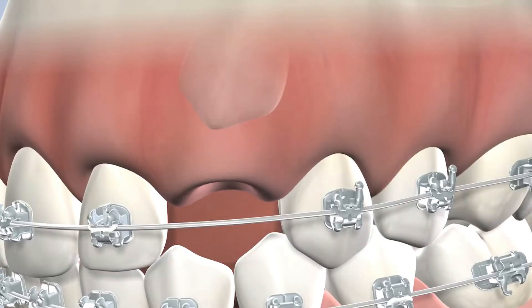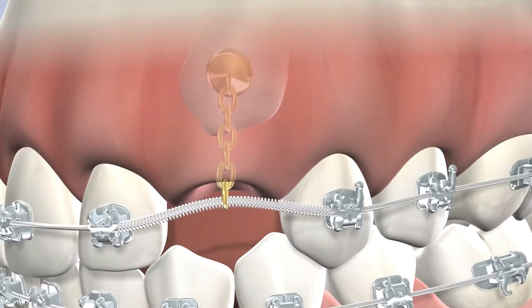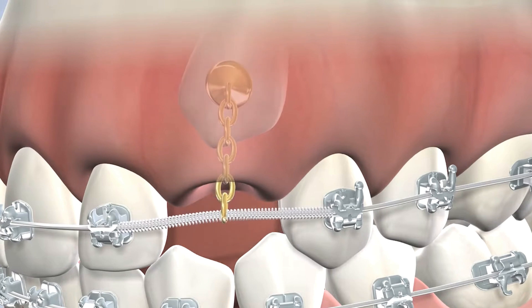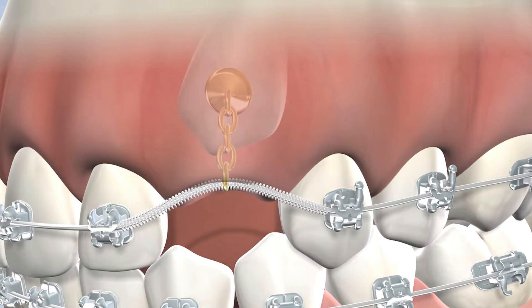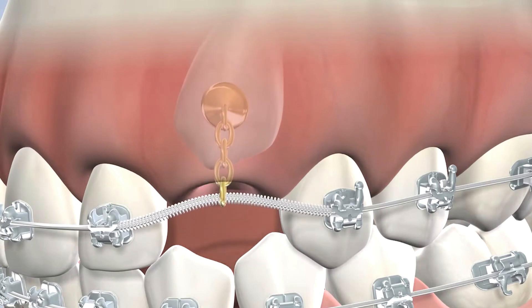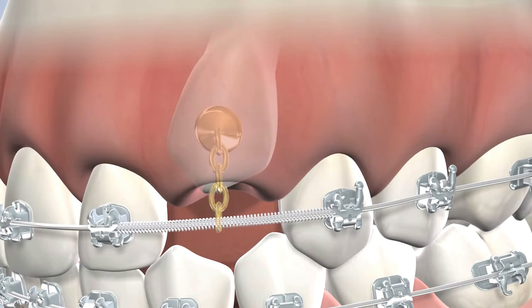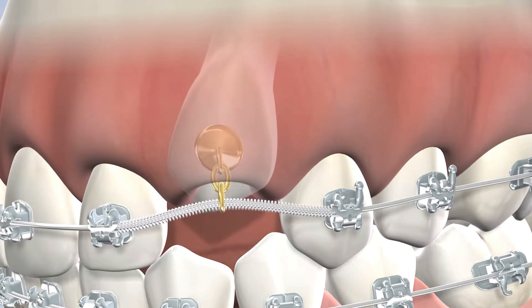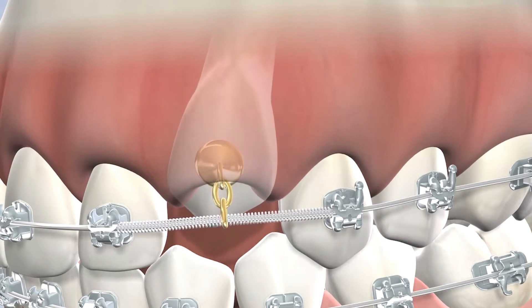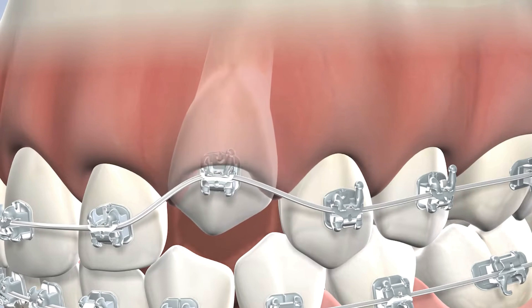Sometimes the permanent tooth fails to erupt on its own. In such cases, a minor surgical procedure is performed to expose the tooth, and then through orthodontic traction, the canine is brought into the arch.